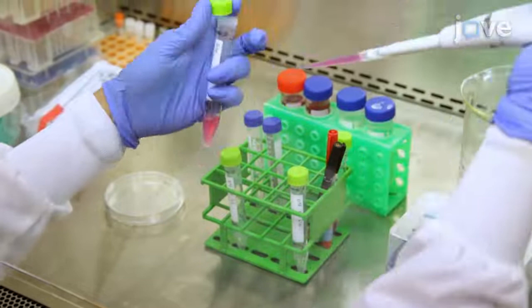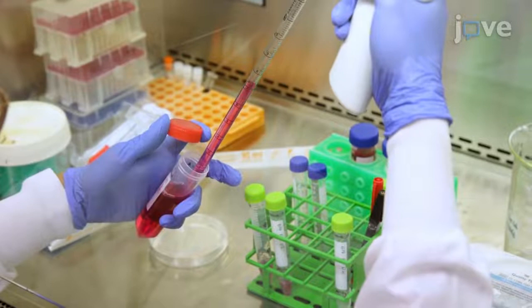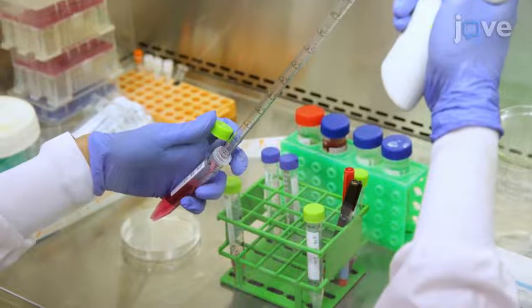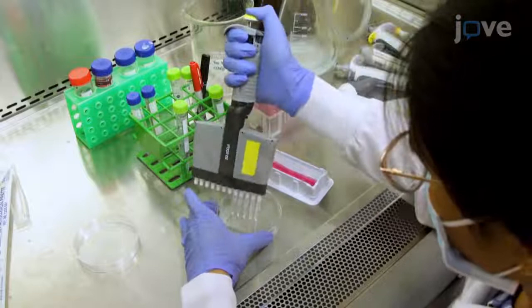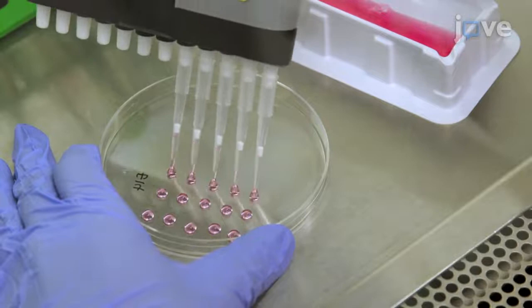Begin by setting up the hanging drop cell culture. For a 10cm cell culture plate, adjust the concentration to 500 cells per 20 µL of differentiation medium. Prepare enough cell suspension for 50 20 µL droplets. Use a micropipet or a repeater pipet to place 20 µL droplets of cell suspension onto the lid of a tissue culture plate, making sure that the droplets aren't too close together to prevent them from merging.